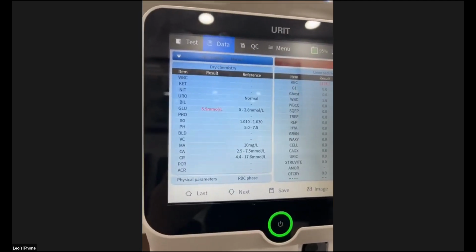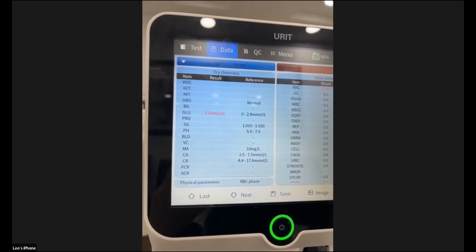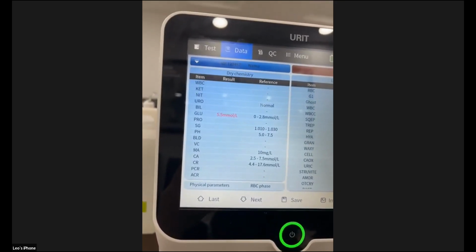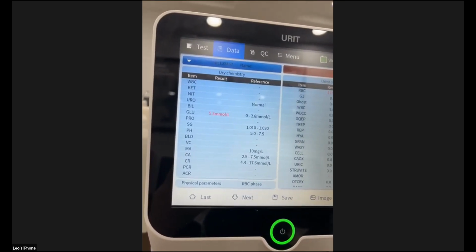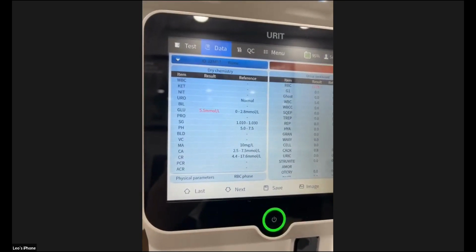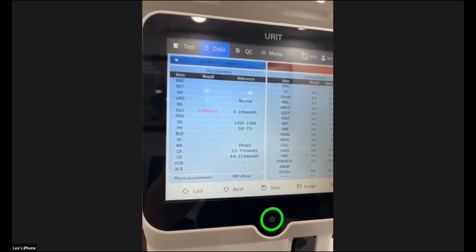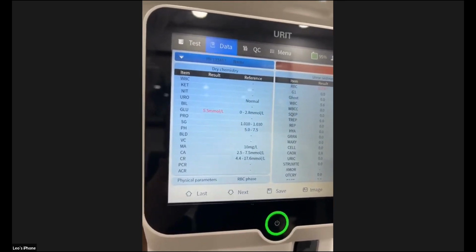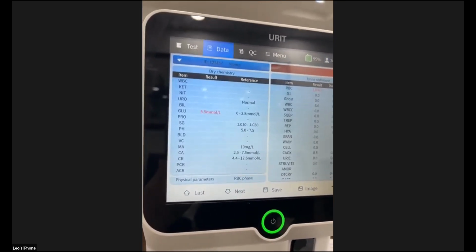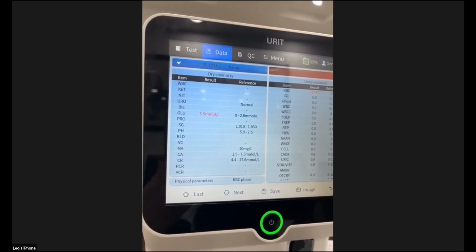So we made a software in the LIS, and then that LIS result goes to their server. So we made a different software for this, only to show those two things. So if it is possible in your software that you can show the millimole value as well as the plus-minus value, that will be very good. Some customers will ask for both, some customers will ask for only one result.